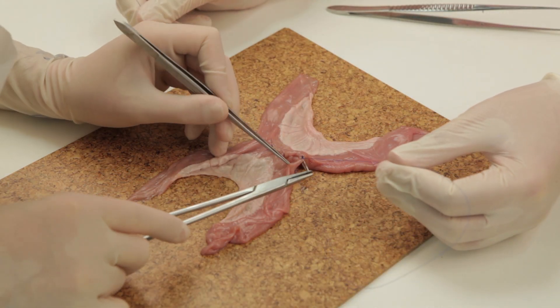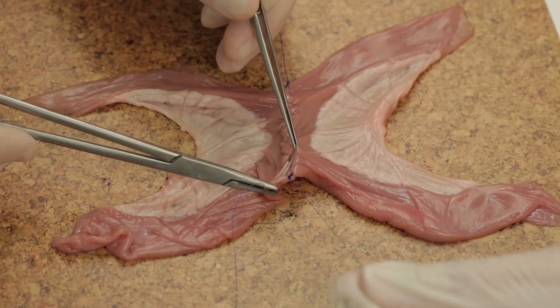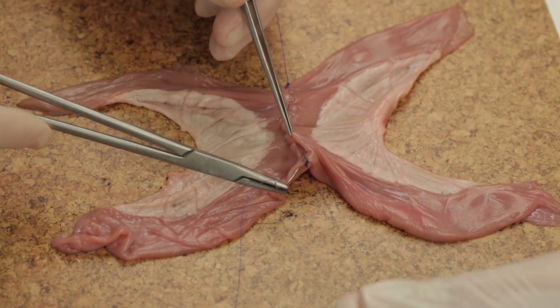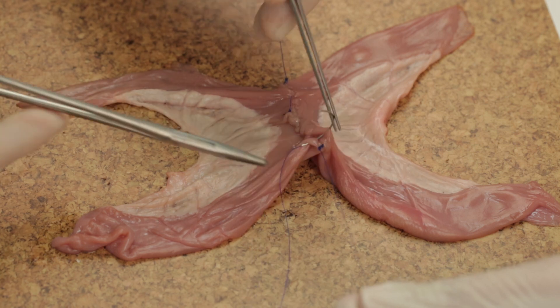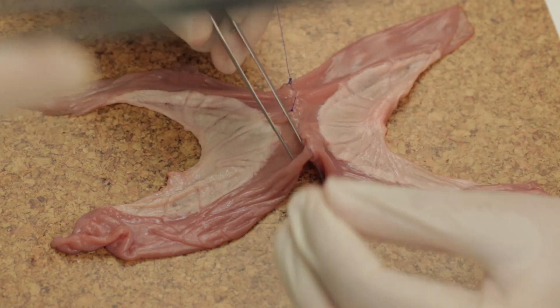The anterior outer wall is completed with the sutures used to form the posterior outer layer. Continue to take seromuscular bites, working towards the midpoint of the anterior wall.